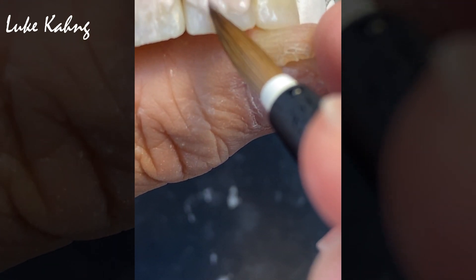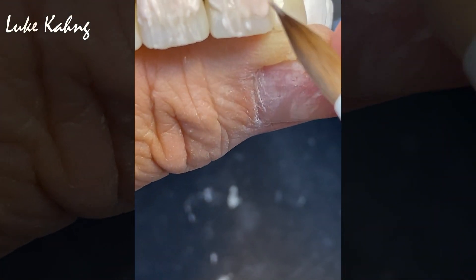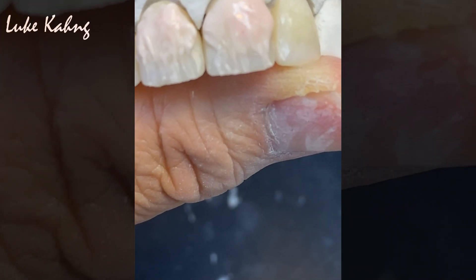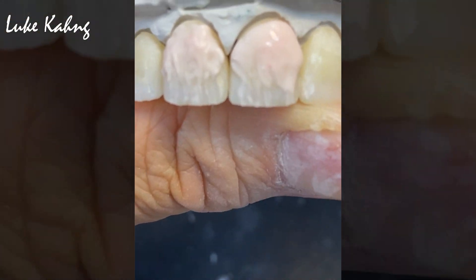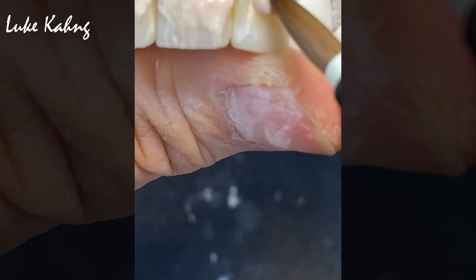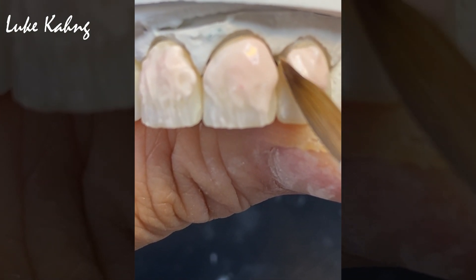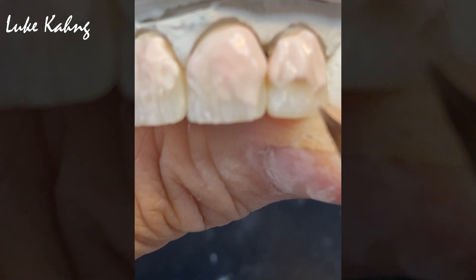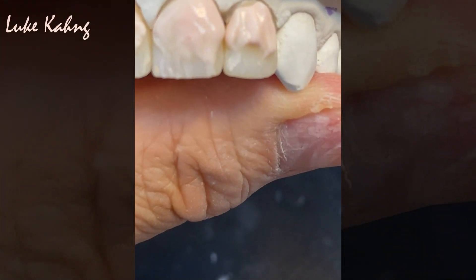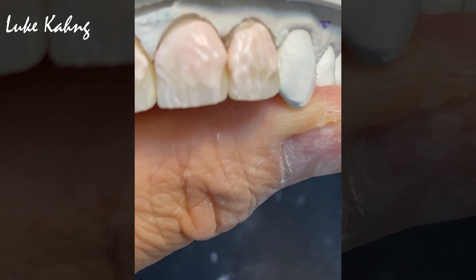From the dentin overlay, here you can see the side view. I created another mamelon together, matched to the same symmetry and same value — otherwise it doesn't look good. The dentin is added from the frame, and here we close the proximal contact with the zirconia. The frame design is key.